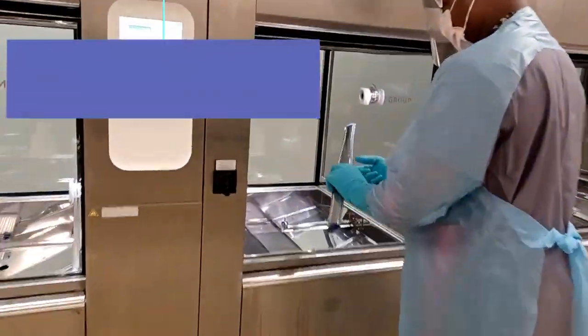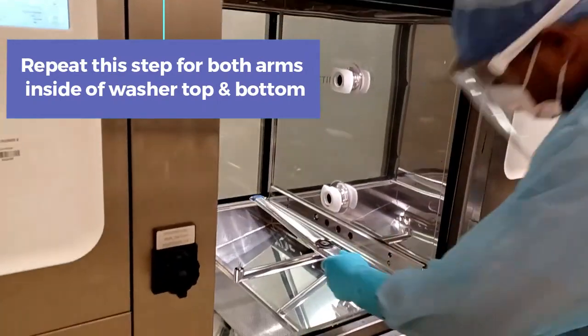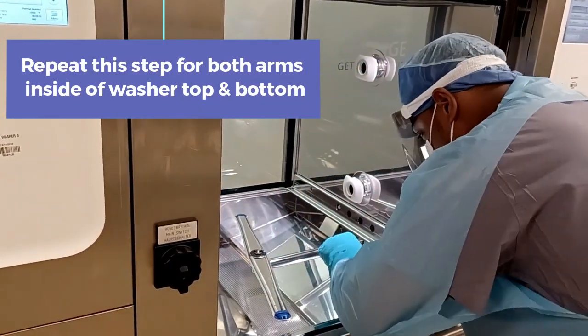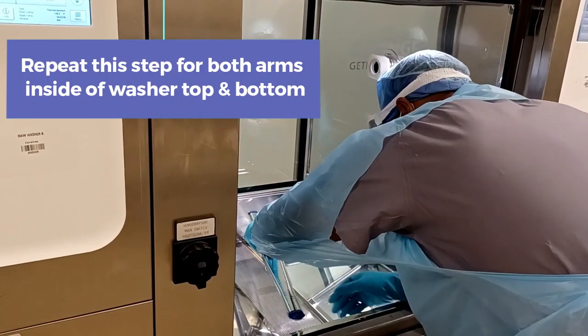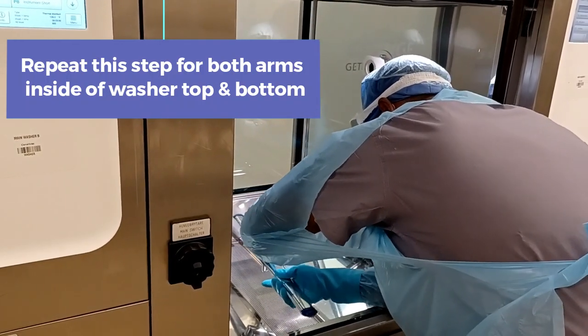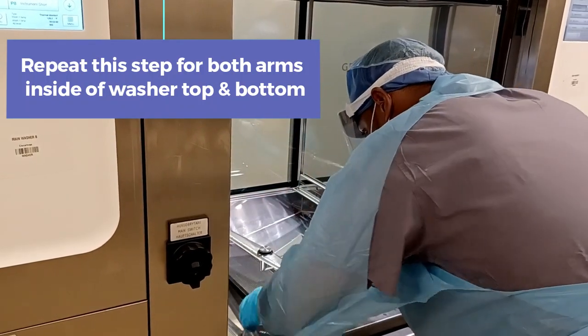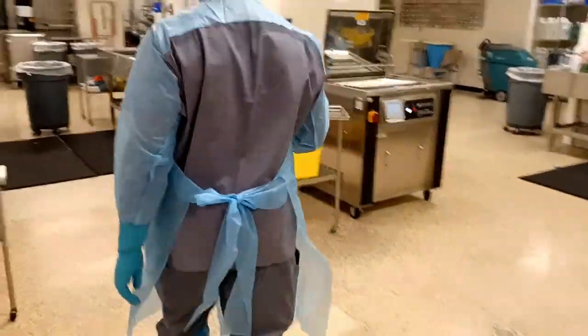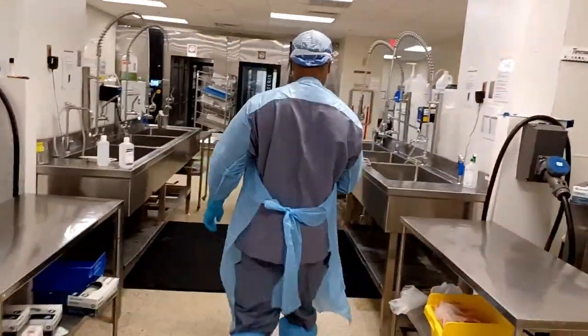Repeat this step of checking the spray arms — there is one on the bottom and also one spray arm on the top. Then you want to remove the internal filter of the washer, dump any debris that may be caught in the filter, and rinse it off as well.